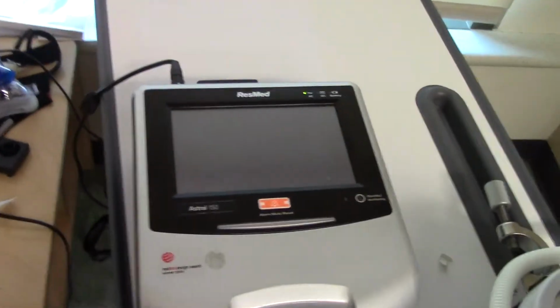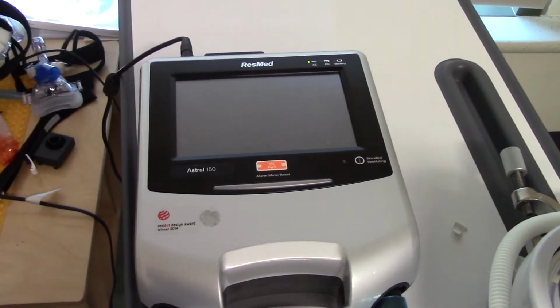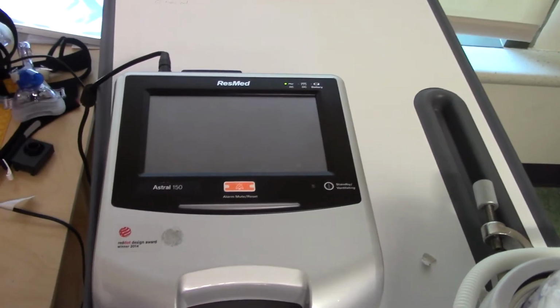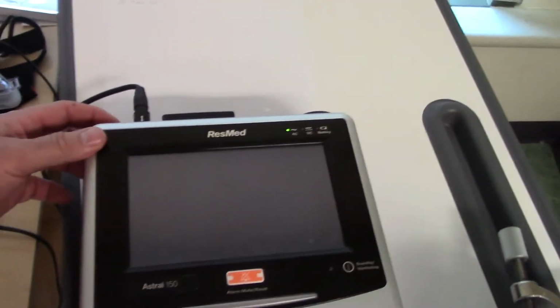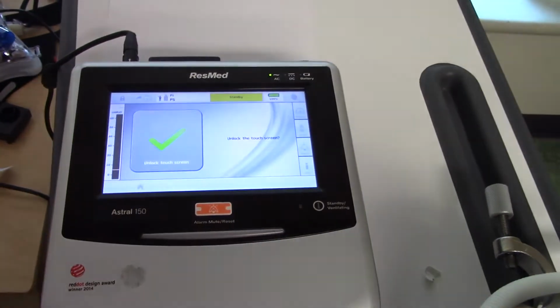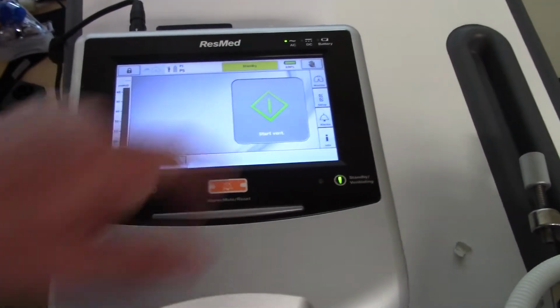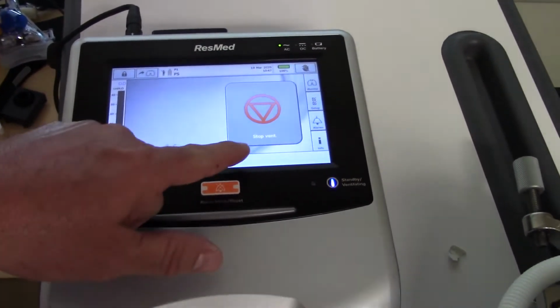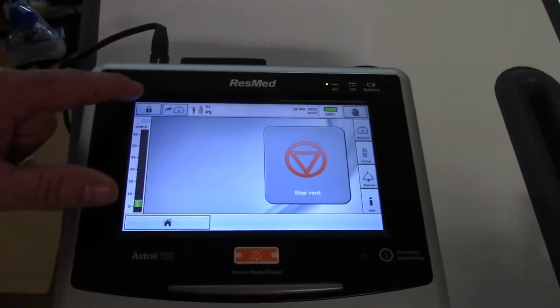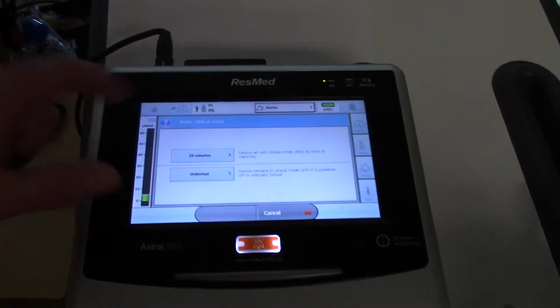So let's talk about little things that are specific, like turning the vent on and getting into the functions and the modes itself on this video. First we're going to turn this on, and it's the button on the top, and you hit it, and when it comes on you see unlock screen, yes. You could start ventilation, and you're going to see it says it's not doing anything. Here's the thing that gets me: you have to hold this lock button down for at least 3 seconds, and you'll come to this screen.